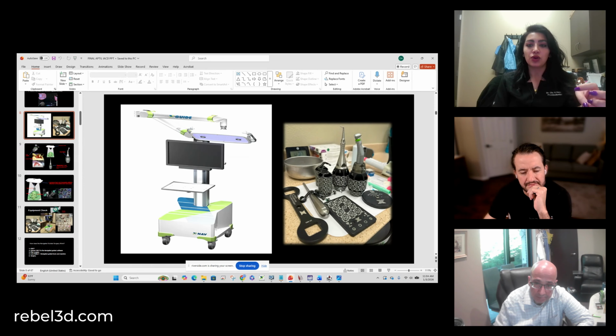Okay, so you're doing your stepwise registration process using those two instruments and correlating them to your tracker that goes in the patient's mouth. Now, how does this go into the patient's mouth, right? If the patient is dentate, let's assume, it will be stabilized to the patient's mouth using the teeth. You can use some of the teeth and a stabilizing material, such as a bite registration material like blue mousse, or whatever material of your choice. You use that to fixate it on the teeth and use the remainder of the dentition to X-Mark, or register, the system.